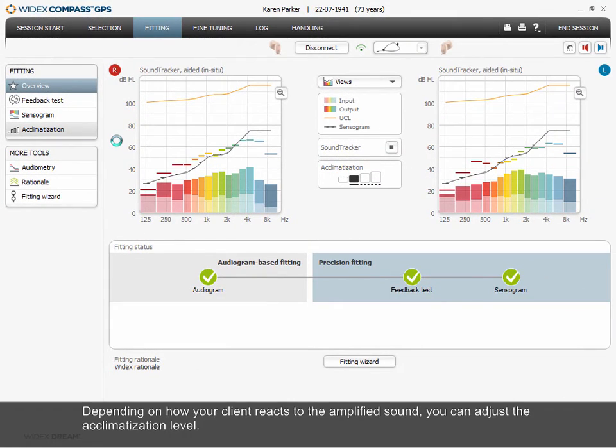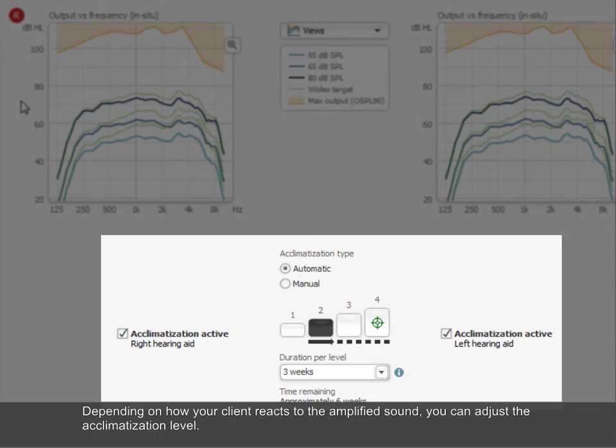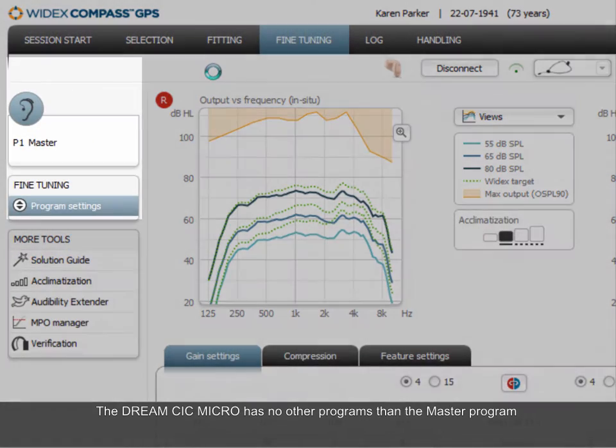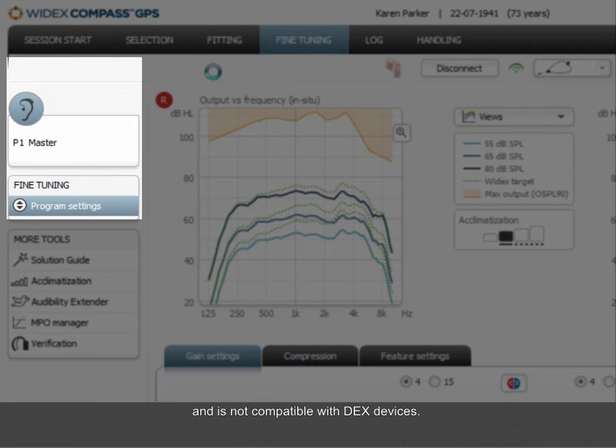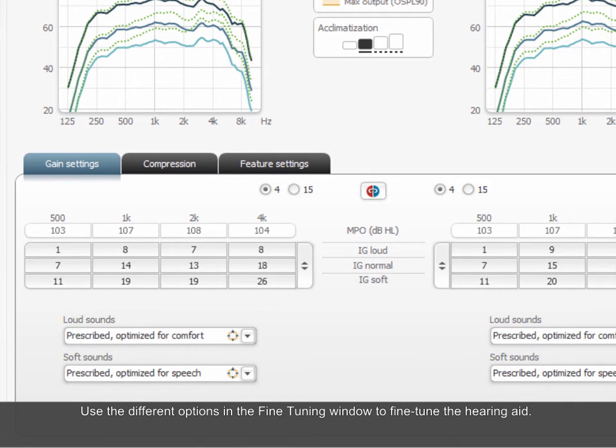Depending on how your client reacts to the amplified sound, you can adjust the acclimatization level. The Dream CIC Micro has no other programs than the master program and is not compatible with DEX devices. Use the different options in the fine tuning window to fine tune the hearing aid.